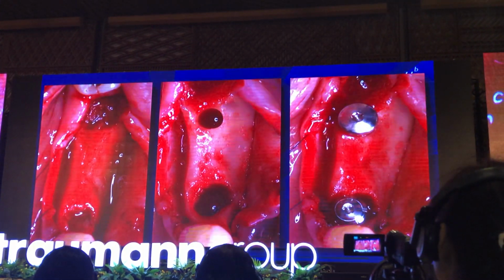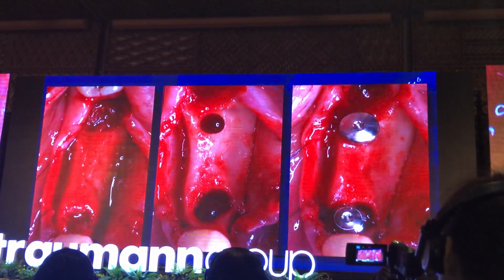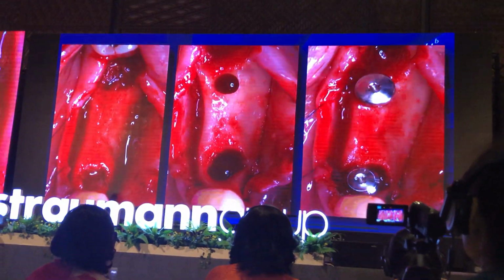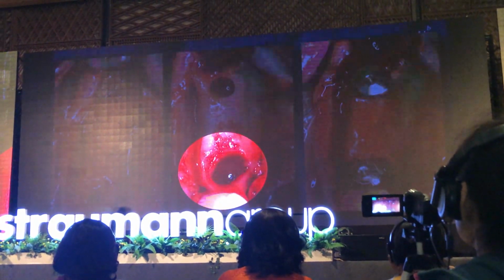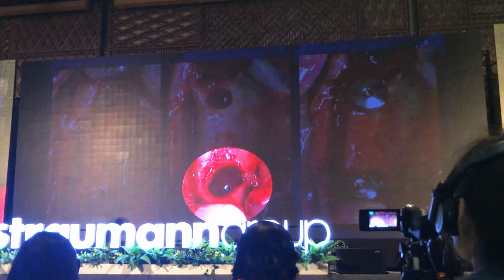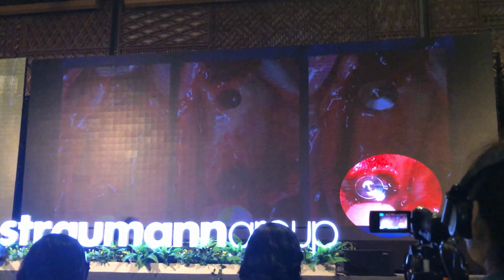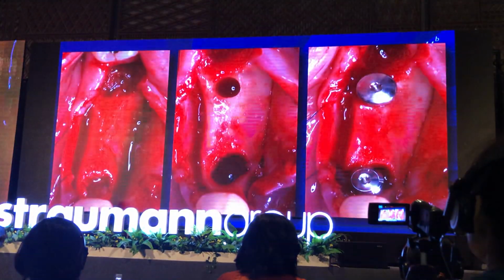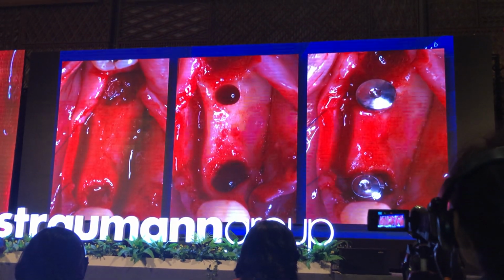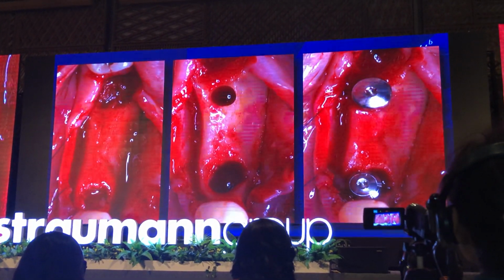At 4 weeks of healing, we went back in, open flap procedure, and you see now that in this area, this is an early placement into a non-healed extraction socket. But you see, we get a very nice two-wall defect. Today, probably, I would use here even an NNC implant, because for a premolar an NNC is perfect.